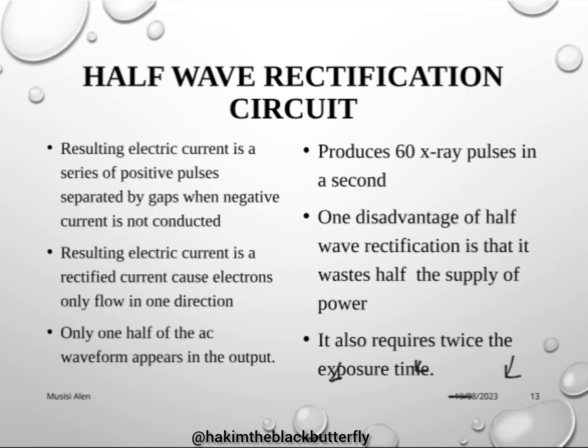It also requires twice the exposure time. The time of exposure is prolonged. For example, if we are using full wave rectification and exposure is 5 milliseconds, for half wave rectification the exposure will be about 10 milliseconds. And these long exposures increase the patient's radiation dose.